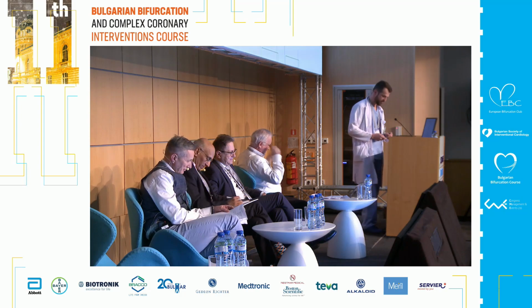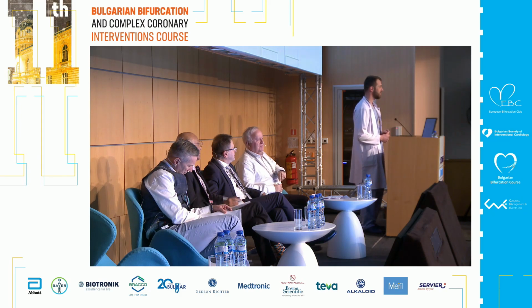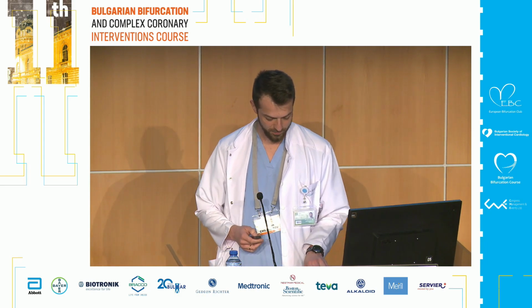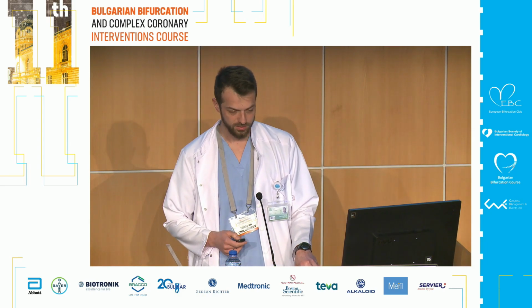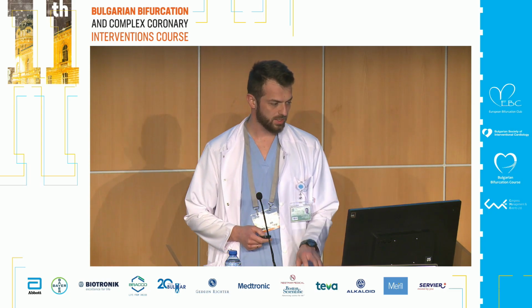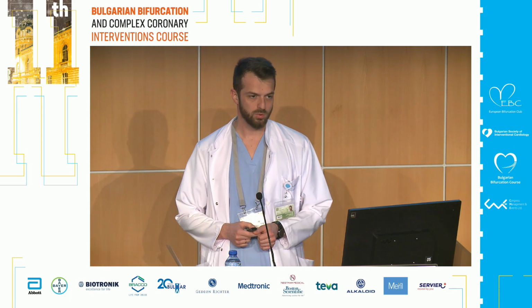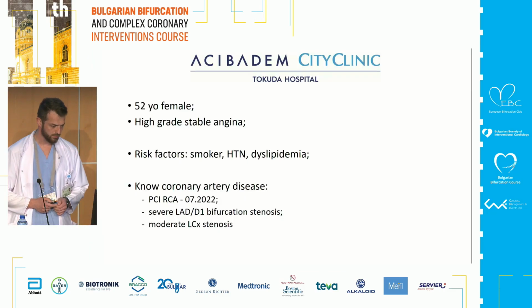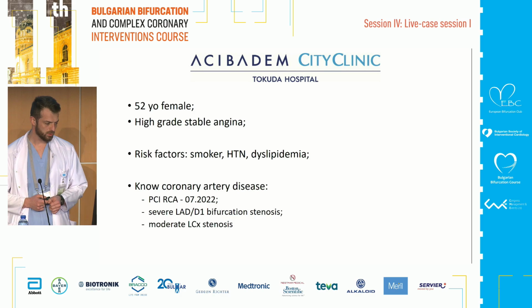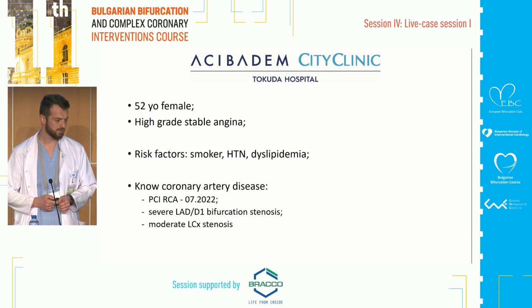Hello, everybody. We are starting with the first cath lab. Professor Rigatelli and Professor Gelev will perform the case. It's about a young female who came to us with high-grade stable angina with a typical risk profile. She's a smoker, has hypertension and dyslipidemia.